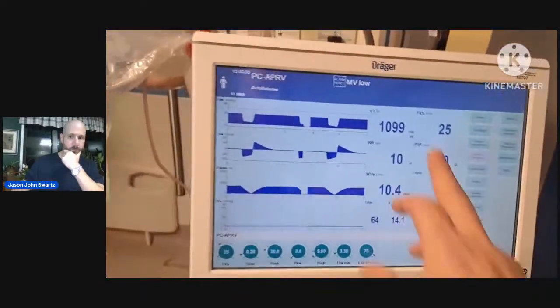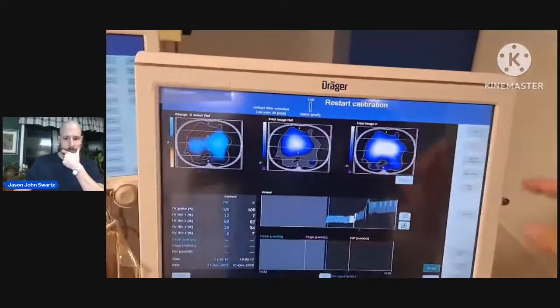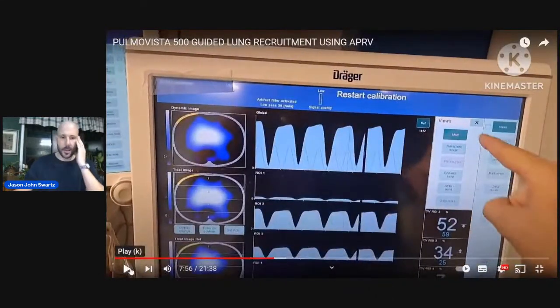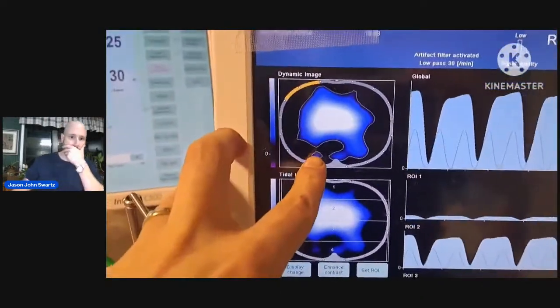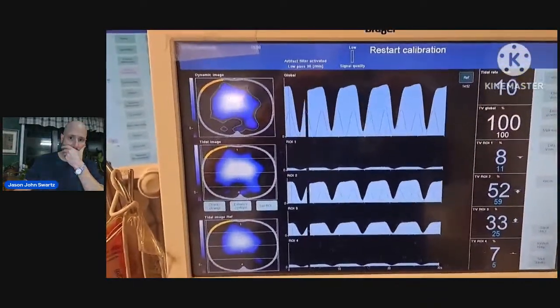The tidal volumes though are quite high over here. So I want to kind of hurry up and get down the P high. I just want to look. Yeah, so I'm thinking, okay, good. Let's see if we can still get this improved distribution of ventilation with 28 maybe or 26. The minute I went to 28, it didn't go well. To see how it's coming along. Not too bad right here. All right, so we're really opening up the lung well.